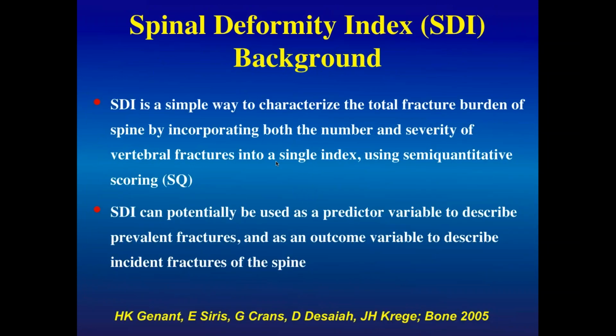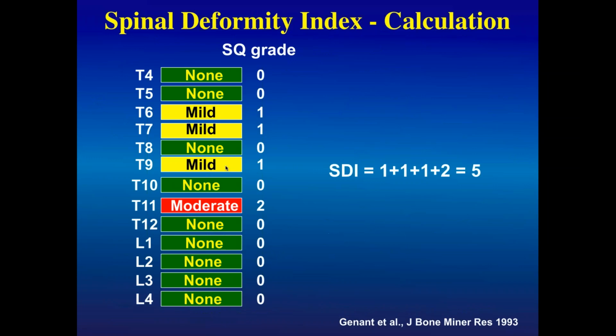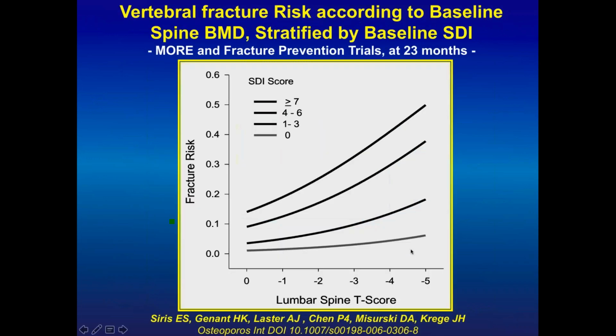Now, another issue that we should discuss is the spinal deformity index. This is a way of simply adding the scores from all of the vertebral levels to give you the fracture burden. So it's a simple means to do that, and it does have relevance.